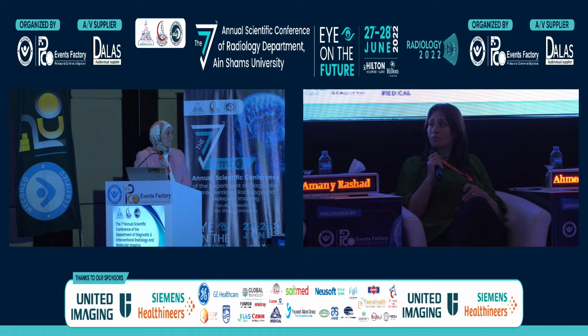Also, it will be helpful in minimizing the second look cystoscopy. After initial treatment of non-muscle invasive bladder cancer, the patient is regularly followed up by cystoscopies and biopsies to monitor if there is any early tumor recurrence. So this MRI can help to minimize these repeated cystoscopies and biopsies. At the end, it is an invasive procedure, and also it is a costly procedure. And you can't imagine how it costs in the Demirdash. Exactly, it is very costly. I didn't know that it is very costly like this in the Demirdash hospital. So if we can replace some patients to minimize these unnecessary cystoscopies and biopsies, this will be good.